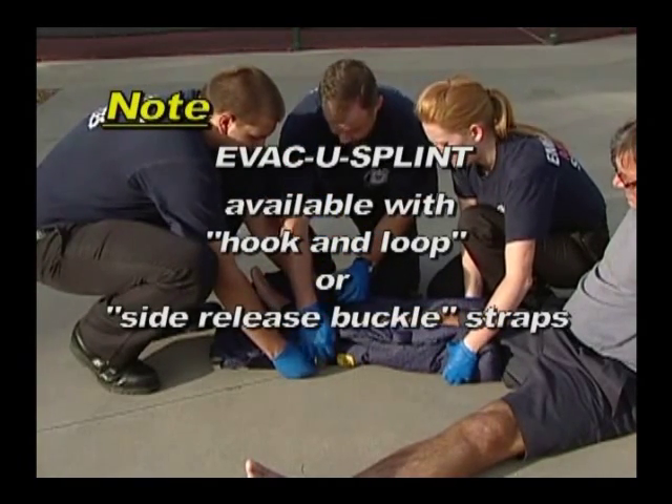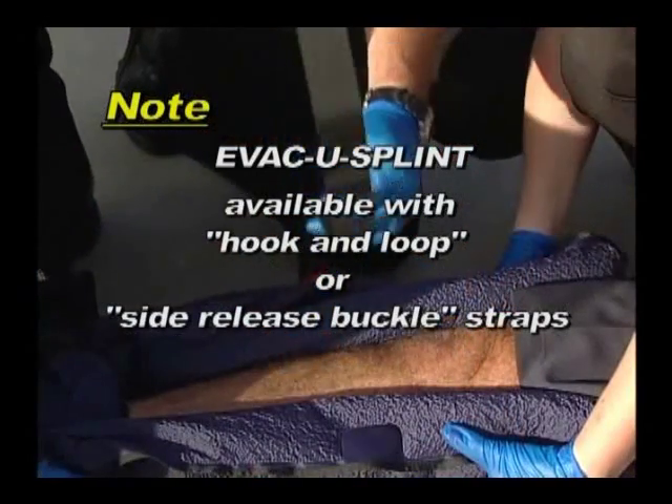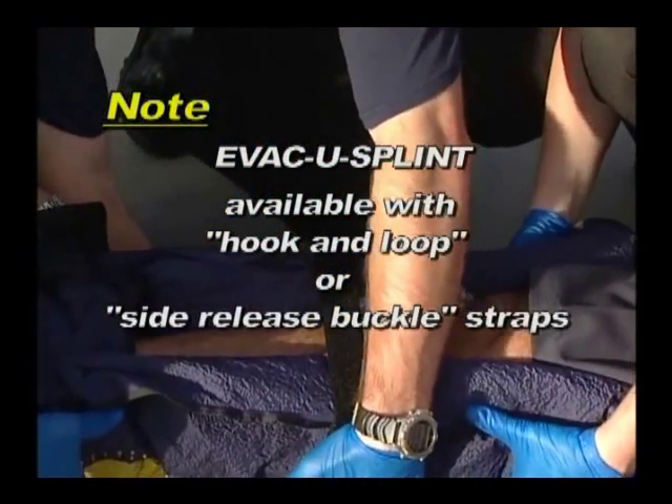The evacu-splint is available with hook and loop or side-release buckle straps. The hook and loop straps are shown here.